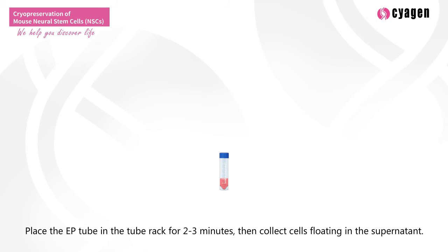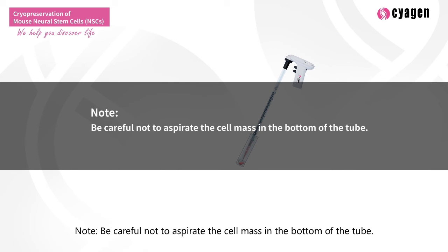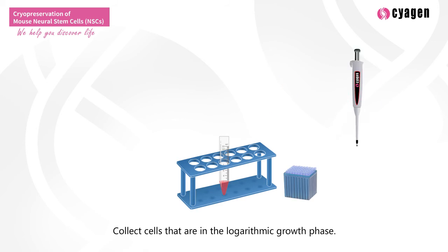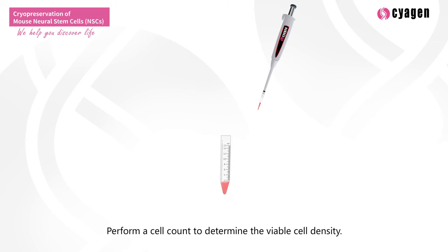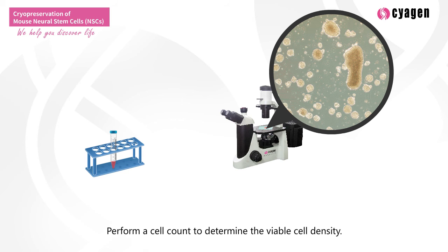Place the EP tube in the tube rack for 2 to 3 minutes. Then collect cells floating in the supernatant. Note: be careful not to aspirate the cell mass in the bottom of the tube. Collect cells that are in the logarithmic growth phase. Perform a cell count to determine the viable cell density.